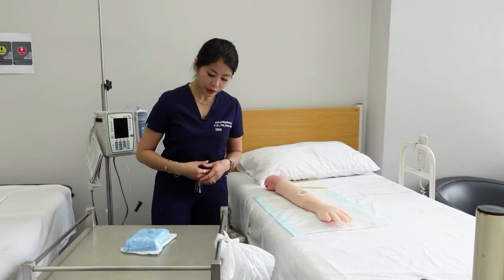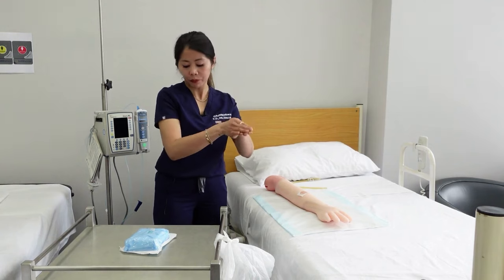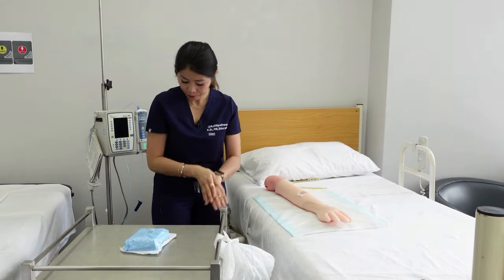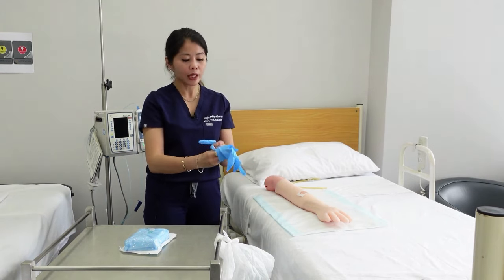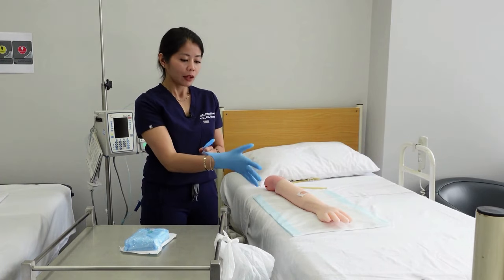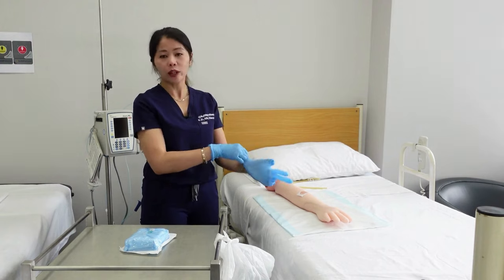When you get to your patient, make sure you perform hand hygiene just before you do your dressing. Grab a pair of gloves. Now technically, your gloved hands are also unsterile, so in simple wound dressing at times you can do it without wearing gloves.